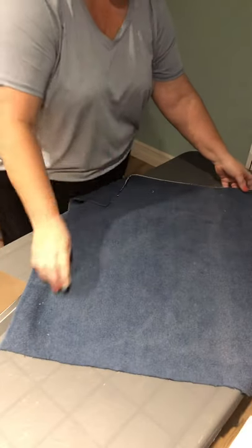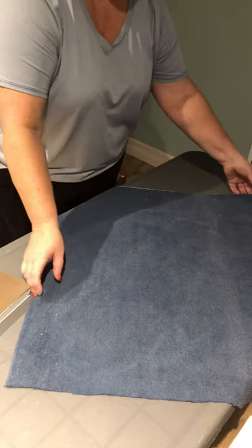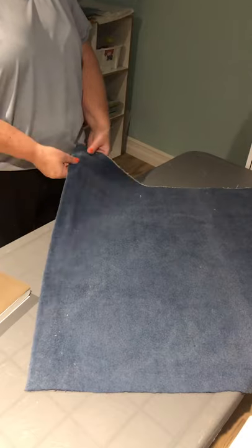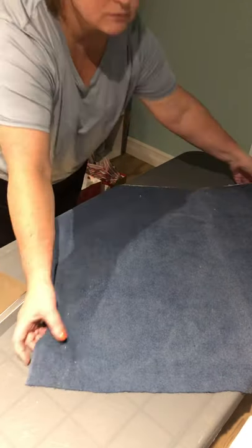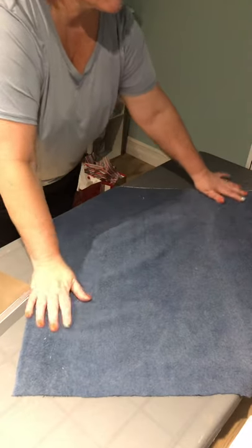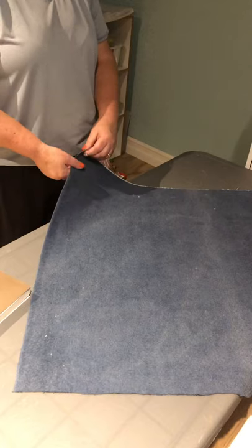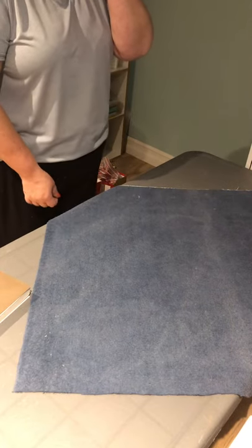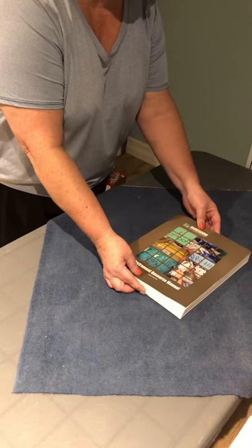So once I've determined there are none of those — no snares, tags, rips, or holes — I'll place the wrapper on the table in a diamond shape with the corners pointing to the front of the table, and then I will place the package in the center of the material.